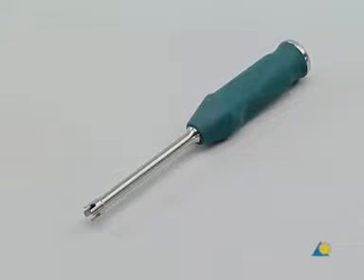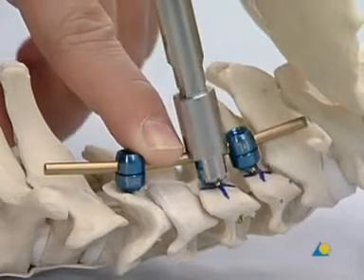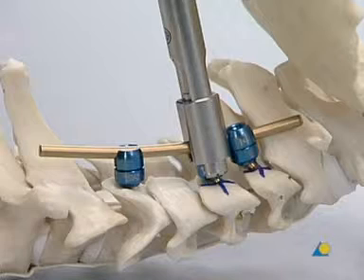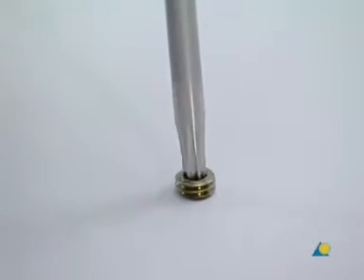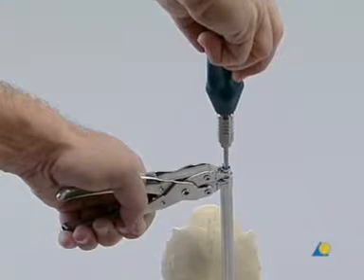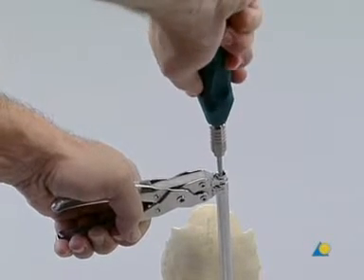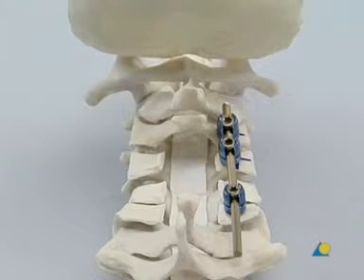Because of the pull-out forces that the rod insertion instrument might exert on the bone screw, the cannulated rod pusher has to be used to insert the locking screw in cases where bone quality is poor. The rod insertion instrument is placed over the variable axis screw head and the handle is squeezed. The rod is inserted into the screw head. The self-retaining star drive screwdriver is used to pick up a locking screw. The locking screw is slid through the cannulation of the rod insertion instrument. The screwdriver is first rotated a quarter turn anticlockwise so that the threads of the locking screw are seated correctly. The locking screw is then provisionally tightened. The rod insertion instrument provides counter force while removing the screwdriver, then is released and removed.